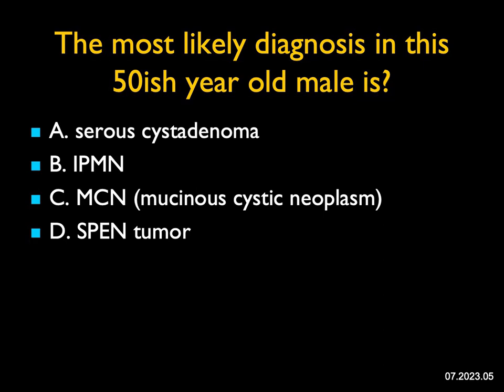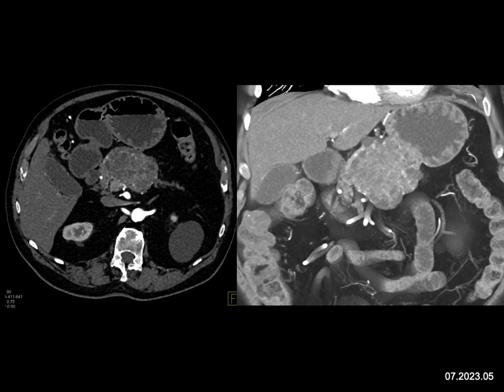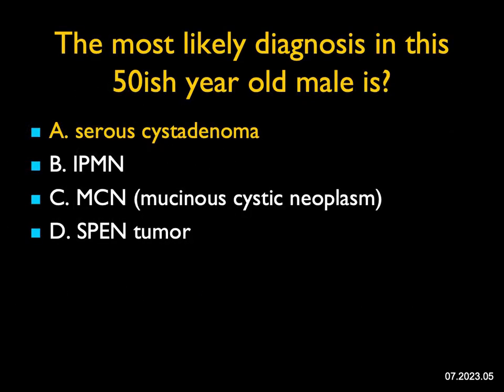The most likely diagnosis in this 50-ish-year-old male — you see a cystic lesion in the body of the pancreas with some septations. Doesn't look like an IPMN. MCN is typically cystic with thin septations, not multiple septations, and MCNs are more likely in females. Solid pseudopapillary tumors can be cystic or solid, but again it's usually female and much younger. What this is going to be is one of the varying appearances of serous cystadenoma. Serous cystadenomas can have central stellate calcification, small or big cysts, and often the cystic component is best seen on venous phase imaging. On arterial phase you might worry about a neuroendocrine tumor, but it's the venous phase that really brings out those cystic changes. So this was a serous cystadenoma.